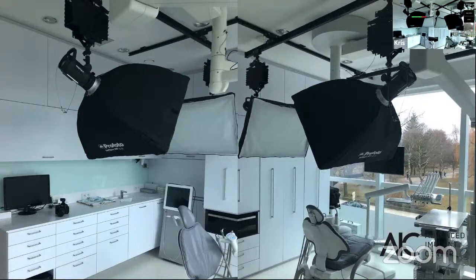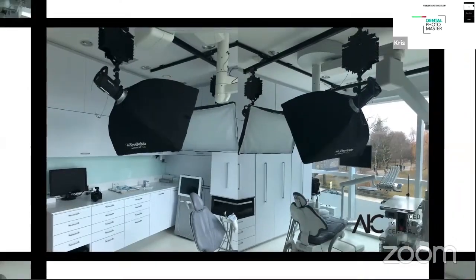And this type of solution I prefer, especially when we want to have a lot of light with powerful flashes, where you are limited with access, which is in my case, especially during surgeries, because I have to take into consideration the safety of the treatment, but as well information for the patient, just to keep everything at a distance and deliver the light in the most, let's say, challenging situations where we have some surgeries.